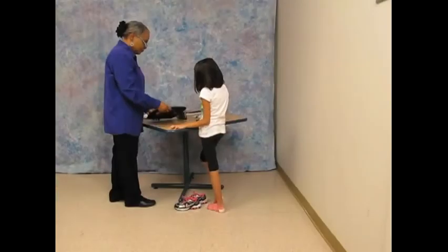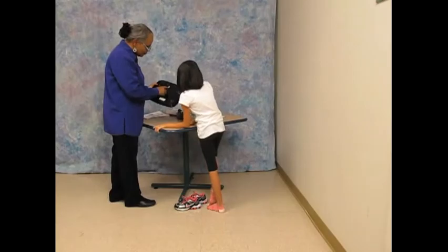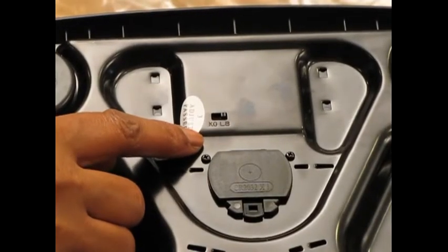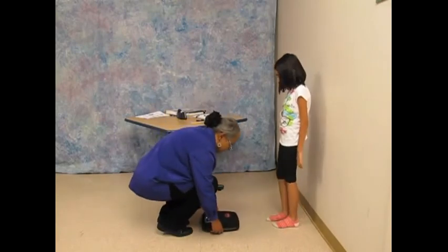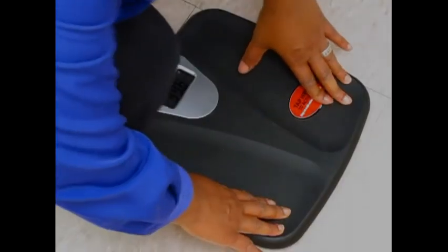Now it's time to measure your child's weight. First, turn the scale over and make sure it's set to pounds. Place the scale on the floor and make sure it does not wobble. Remember, the floor should not have rugs or carpet.